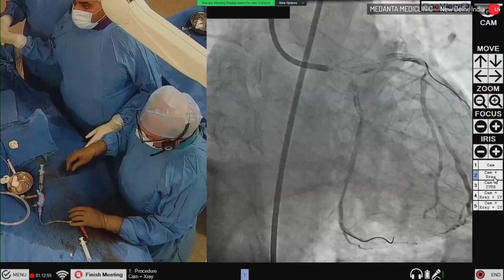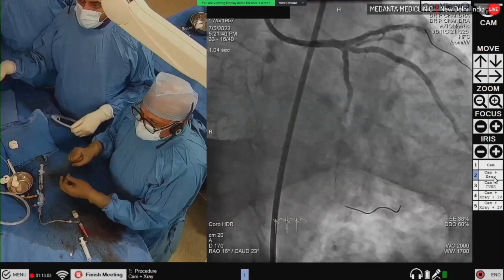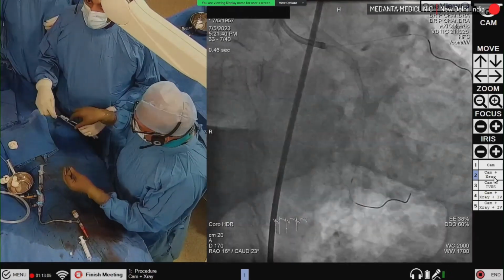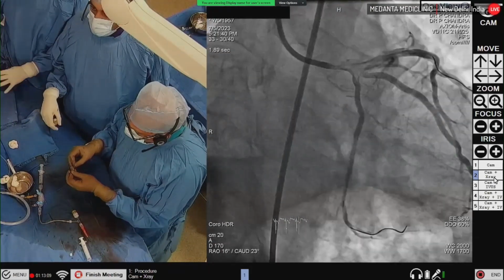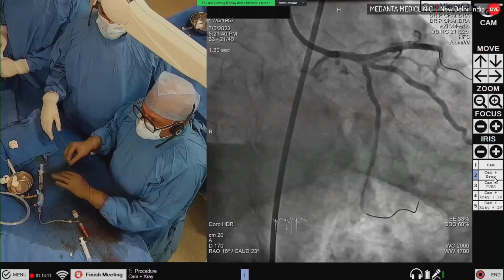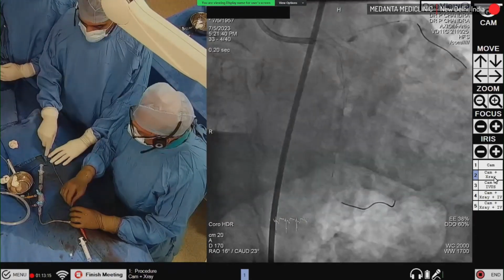Yeah, that looks nice. So we are okay. The distal part is ballooned with a DEB, and proximally we have put a stent. So this is kind of a hybrid, which we do sometimes. If the proximal lesion needs stenting, then we go with stenting.